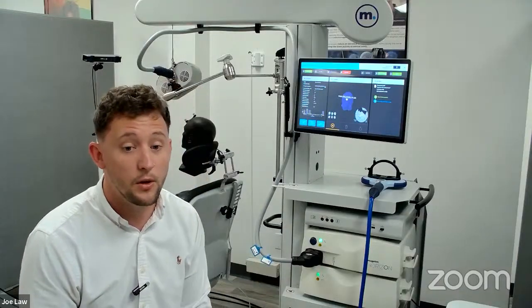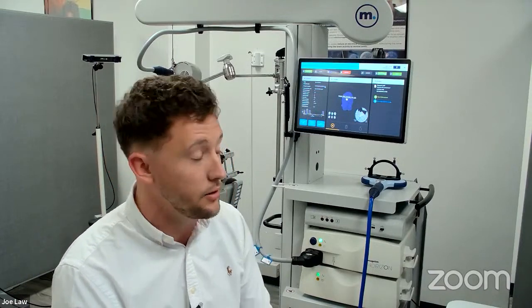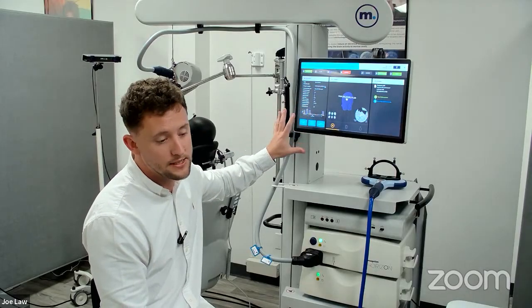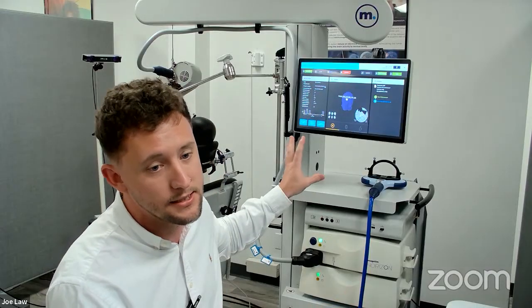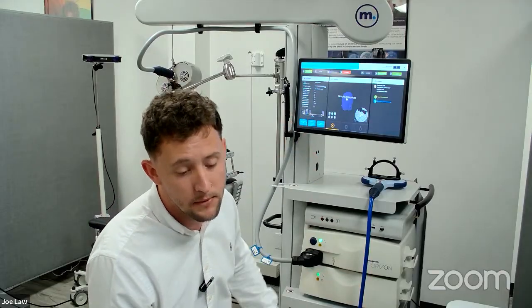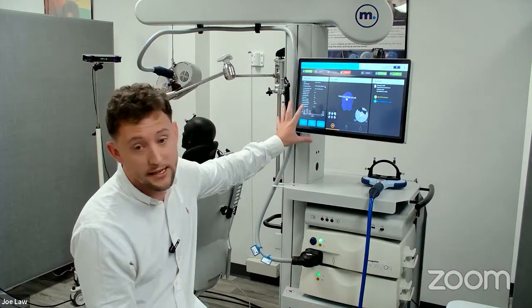Sure. So again, we have something called PDM and analytics. You can use the system to input data, export data. That's not a problem, the system itself. But we also give you cloud-based access, so you don't have to be at the system to access this data. As long as you've got credentials to log into this system, you can open up a desktop or laptop web browser, go onto PDM, Magstim Connect, and log in using your credentials. That'll give you access to this and more.